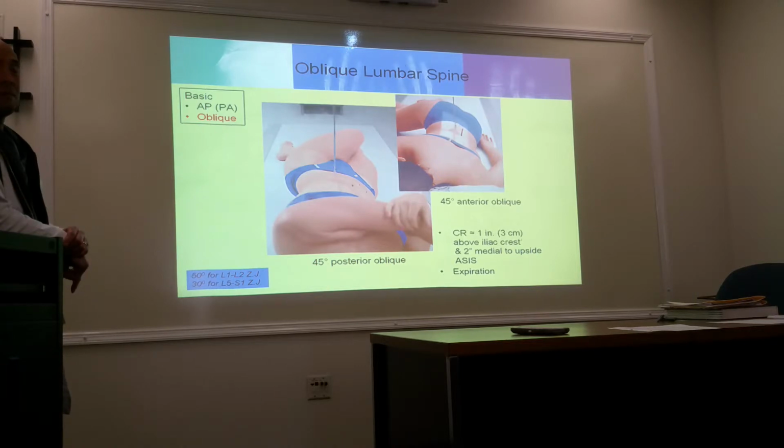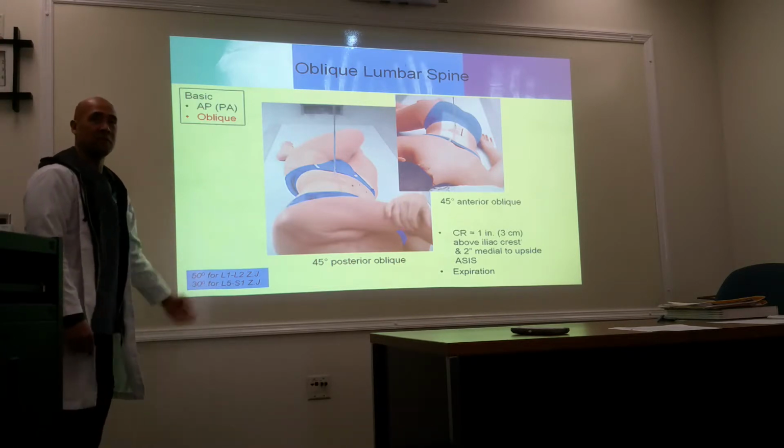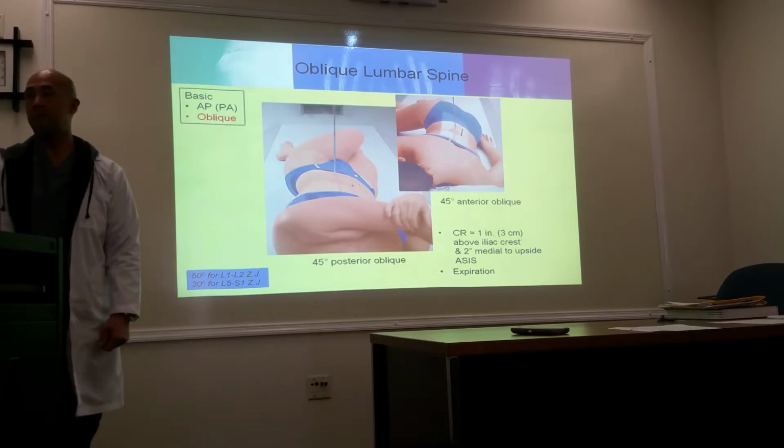Cross out the 45s. That's for mid. No, 45 is generally what you're going to do. That's your standard practice, for the mid lumbar. This is just supplemental if you want to focus on different parts of the lumbar.